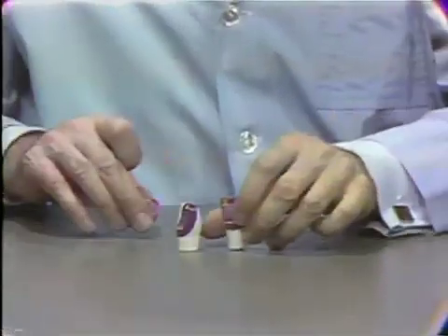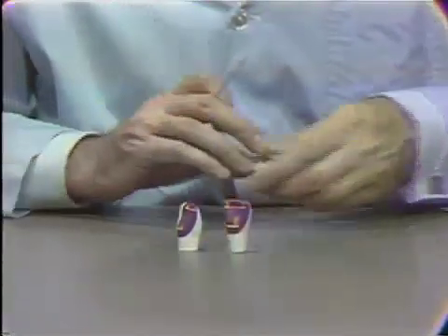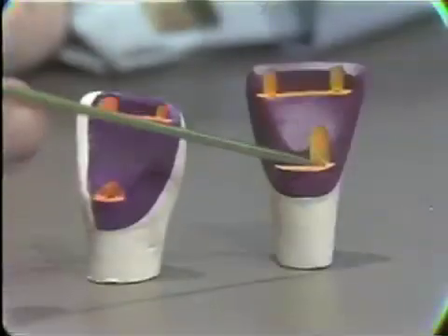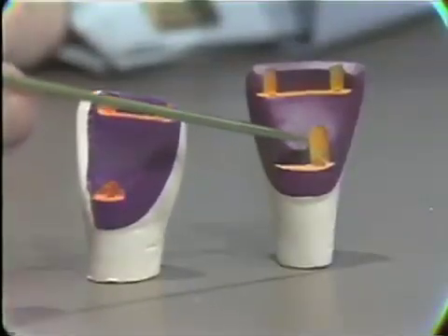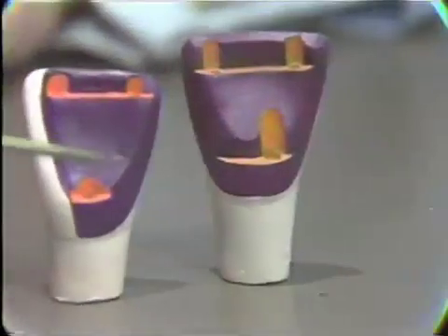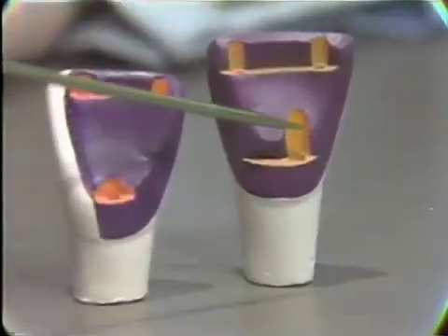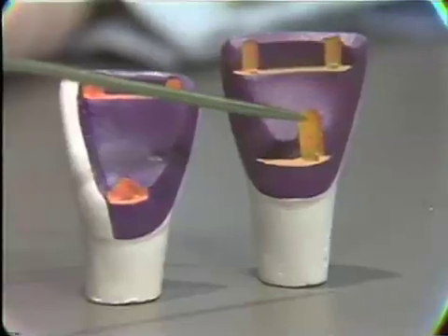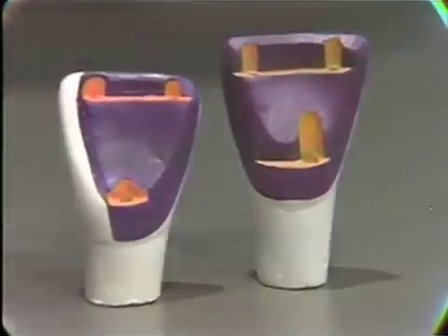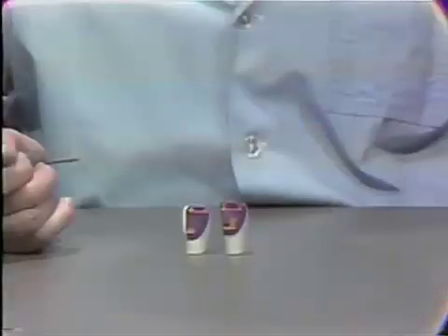It's sometimes convenient to modify the position of the cingulum pin, and in this model here we can see that the cingulum pin has been offset to one side. Here you see it in the central position. On this model here it's offset to one side to avoid close proximity to the pulp in that particular situation.